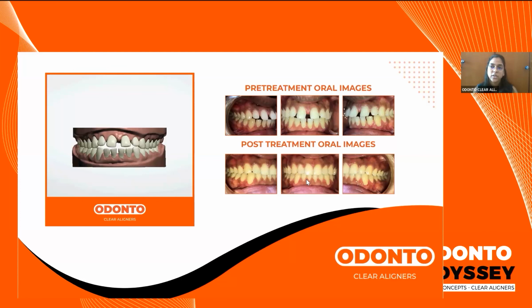If they are anterior teeth, then we can always have a higher amount of correction, because the shape of the tooth is such that it has a surface wherein the aligner can go and hold better around it, and we can bring about correction. In those also, anything beyond 20 degrees, we require the use of auxiliaries, in terms of buttons and elastics, which will help us with the rotation of the same. So that is how we proceed. Any other query that anyone might have, or anyone else wishes to ask?